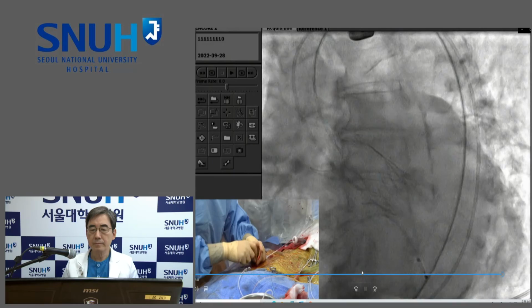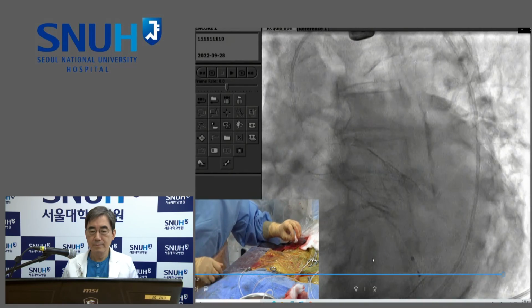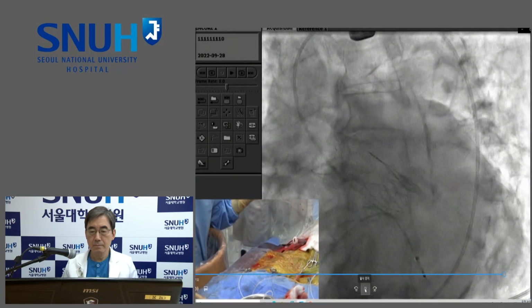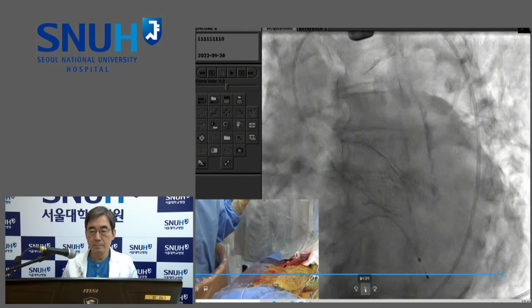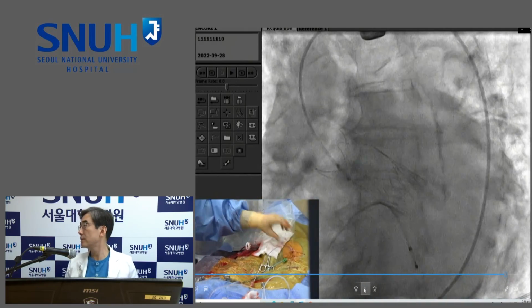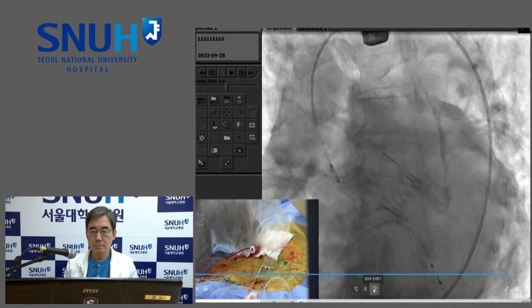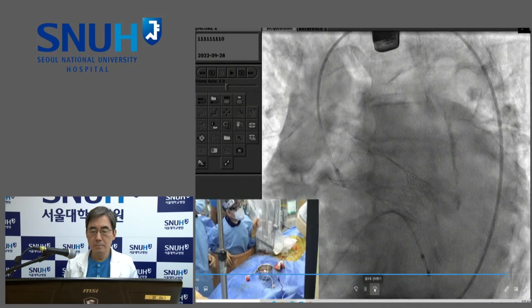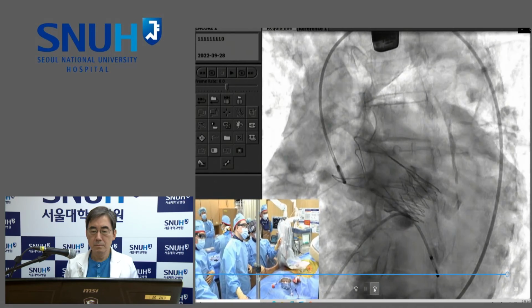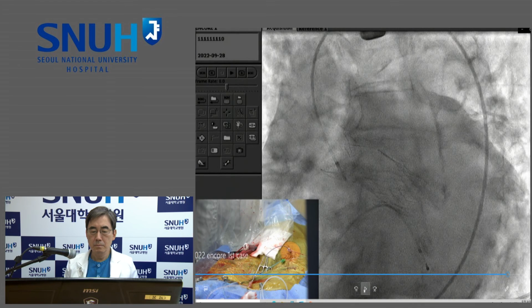I think we have to be a little bit careful because none of the valves have been compared head to head with respect to valve thrombosis. It's similar studies, similar populations, but not direct head to head. So I would caution a little bit on drawing the firmest conclusions about thrombosis rates. The previous registry comparing head to head the Accurate Neo first generation versus Sapien showed worse outcomes with the Accurate Neo, and the Accurate Neo 2 is better, of course. So we need head-to-head comparison.